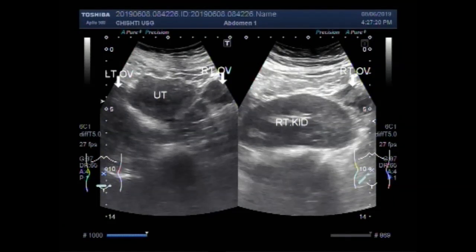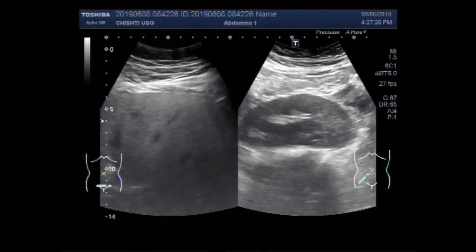Dear viewers, I hope you are all fine. This ultrasound video shows an ectopically placed kidney.